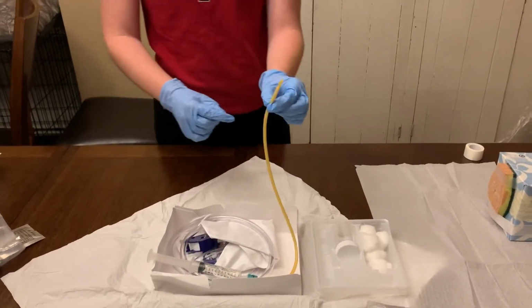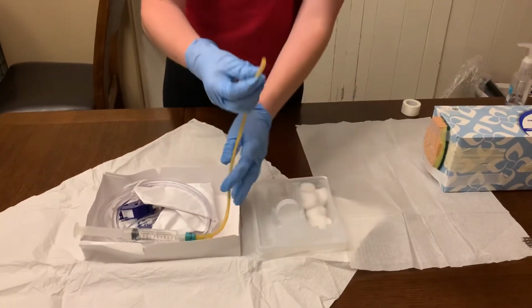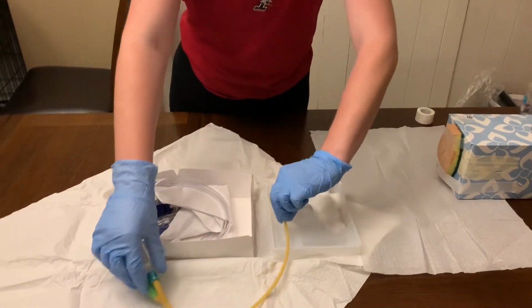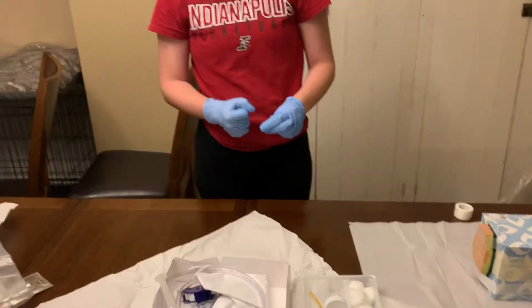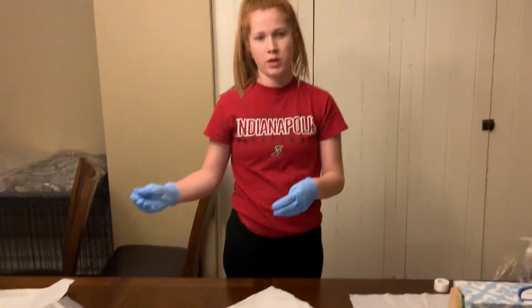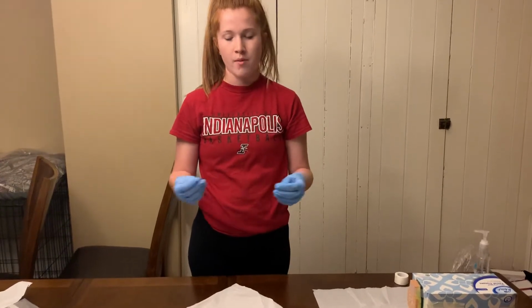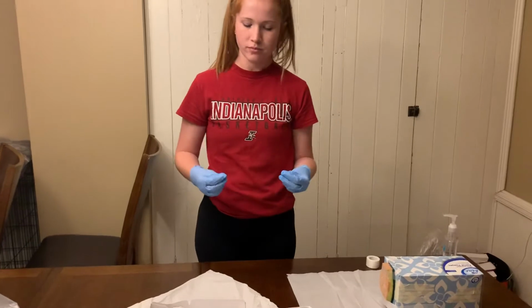And then I will take my catheter tip and lubricate that and just rest it in the tray, keeping it sterile still. Okay. One thing I'd like to note is when I was putting my sterile gloves on, it's important that you keep your sterile field in view. I just wanted to note that before moving on.